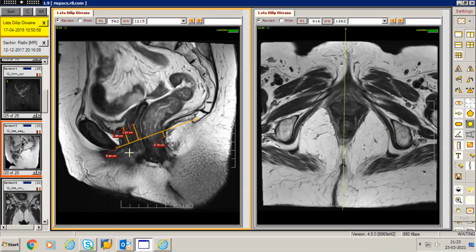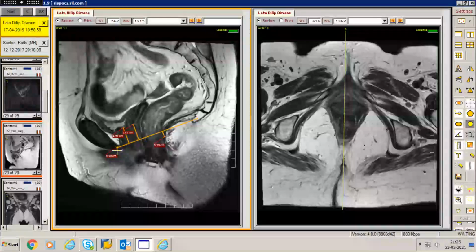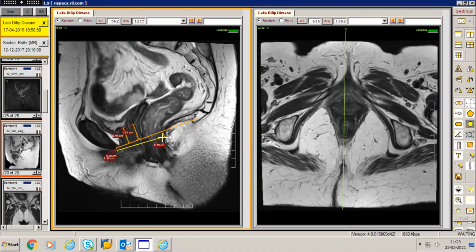There is another line which is drawn from the inferior margin of the pubic symphysis, joining the anorectal junction. This basically refers to the levator hiatus. The hiatus basically is the gap between the levator muscles through which all these pelvic organs traverse and go inferiorly. That is why this line is called the levator hiatus line, or the H line.